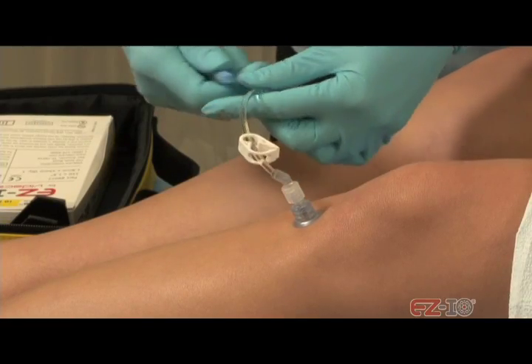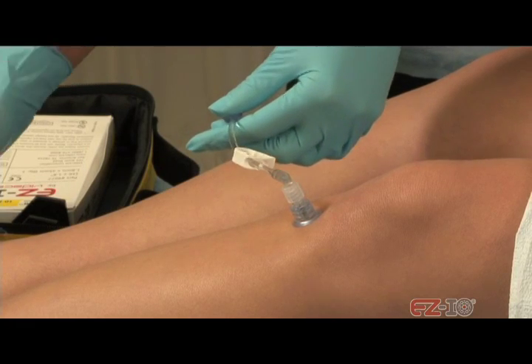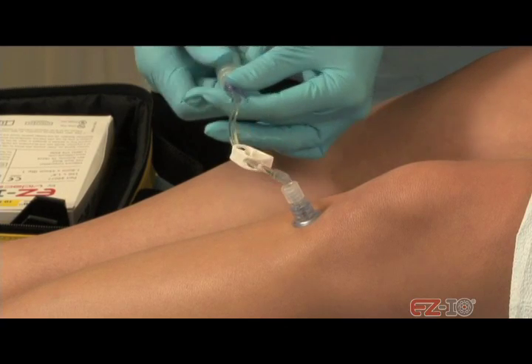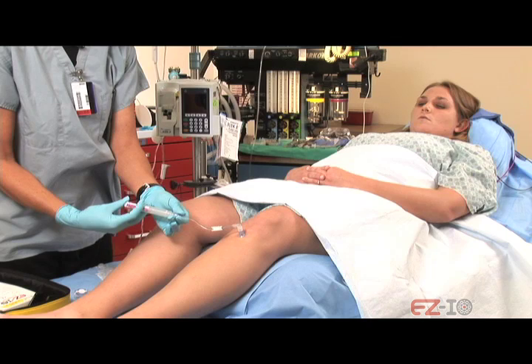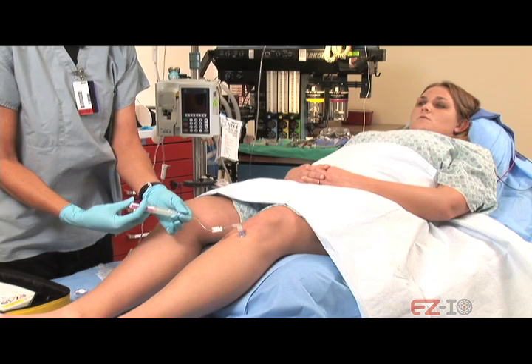I'm going to give you a little more lidocaine to manage that pain. Doing okay still? What's your pain level? Like a 3.